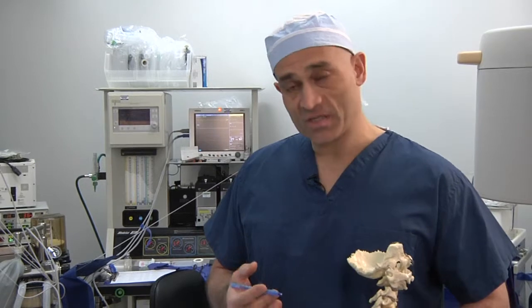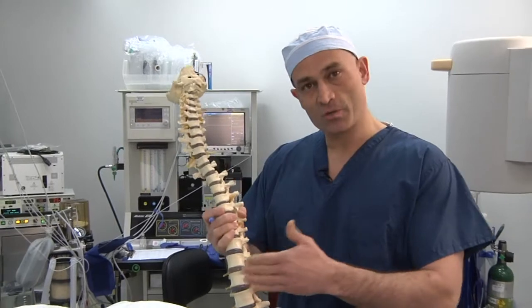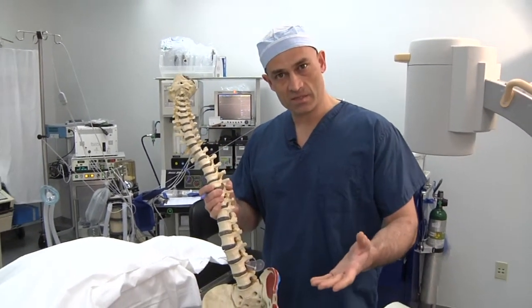Sounds like a long name? It's a name for a procedure that we use to help people who've sustained injuries to nerves or have got inflammatory processes happening in the nerves which can lead to leg pain. And to demonstrate the procedure, what I'd like to do is to use this plastic model of the spine to show some of the anatomical elements and some of the technical details of the procedure.